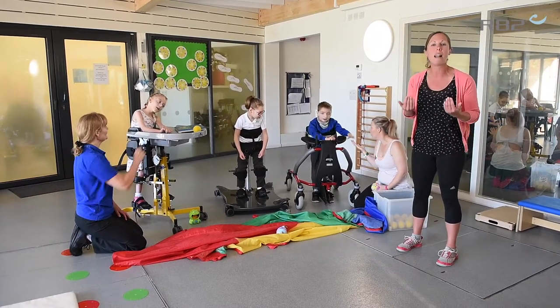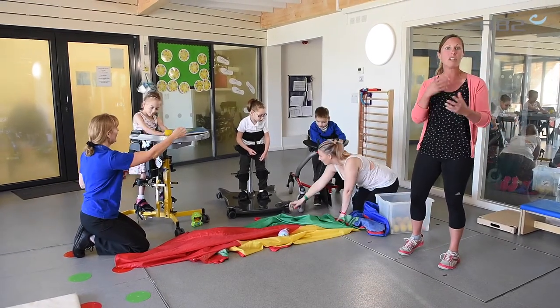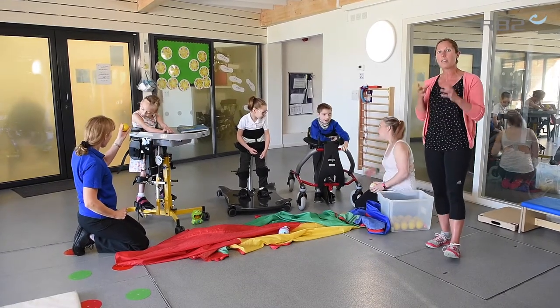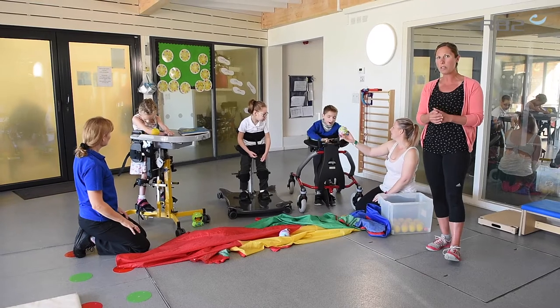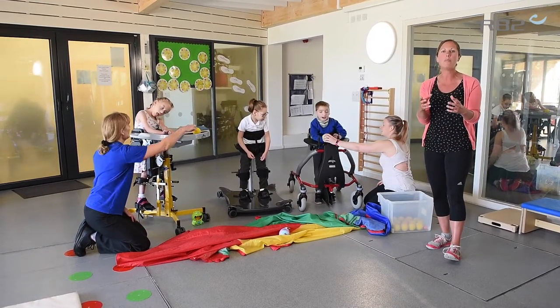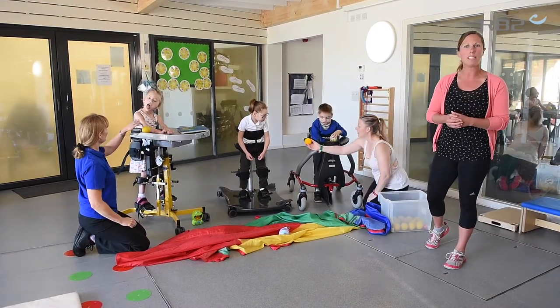So we can challenge that balance and that movement and coordination to help with stepping and walking when we're transitioning into something with much less support. It's about supporting motor skill performance by challenging from the point of instability while allowing some dynamic movement from a static position. So it bridges the gap between these two products.